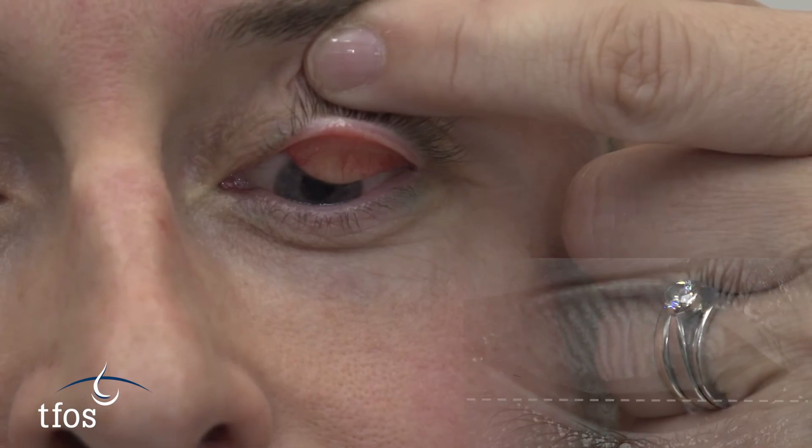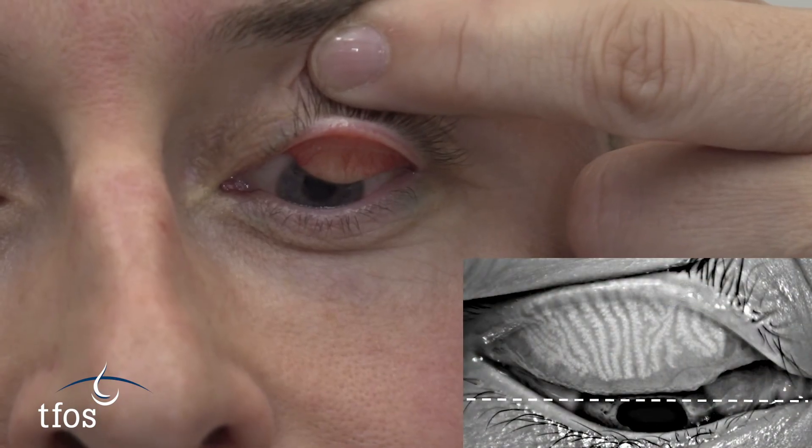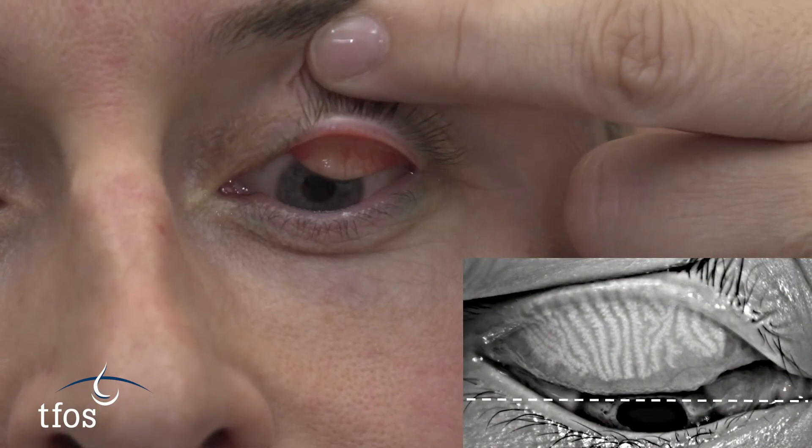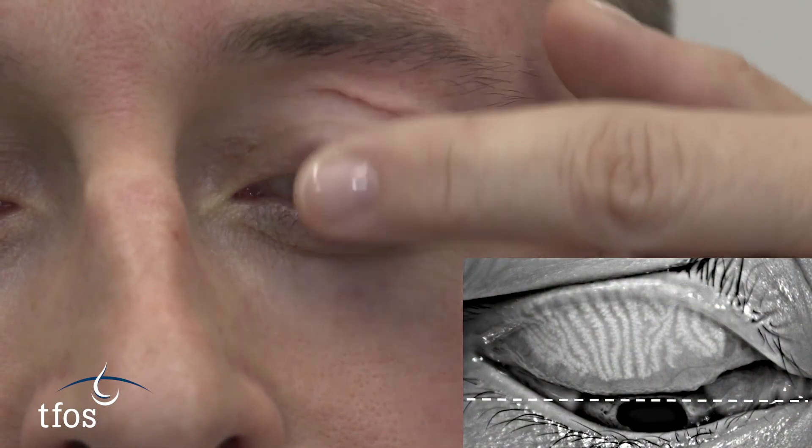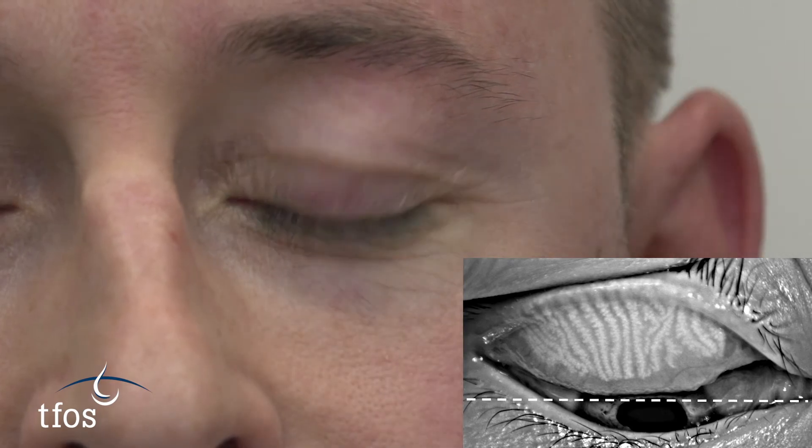For imaging purposes, the averted edge of the tarsal plate should be as close to the horizontal as possible.